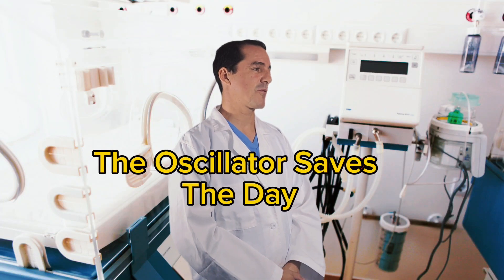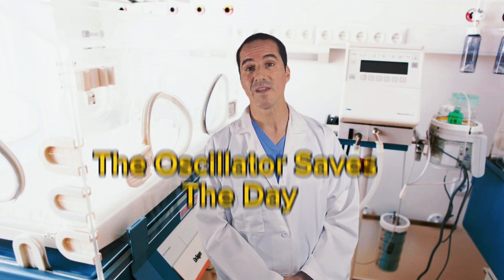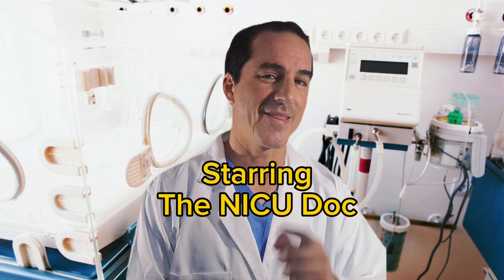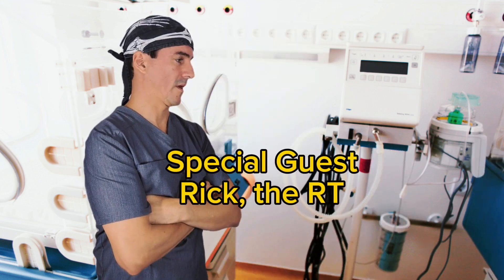The mechanical ventilator is not working. We need to try a different ventilator, so we're going to bring in the oscillator. Already working on it.